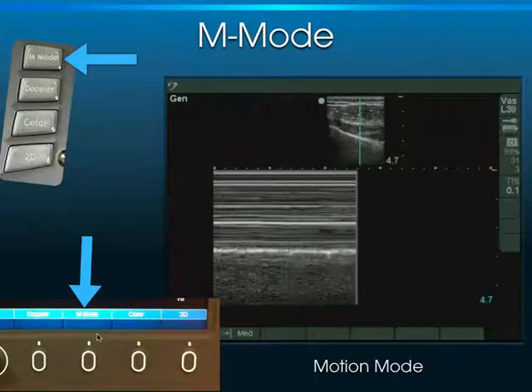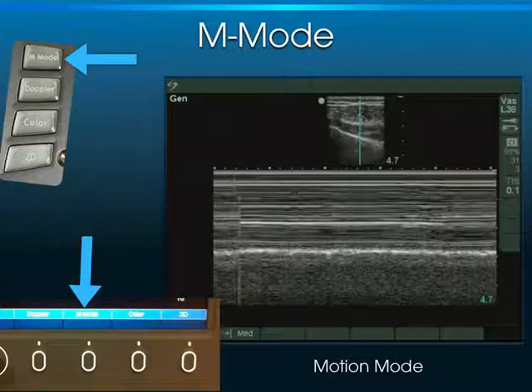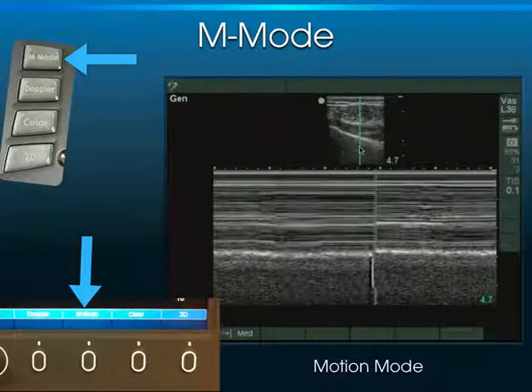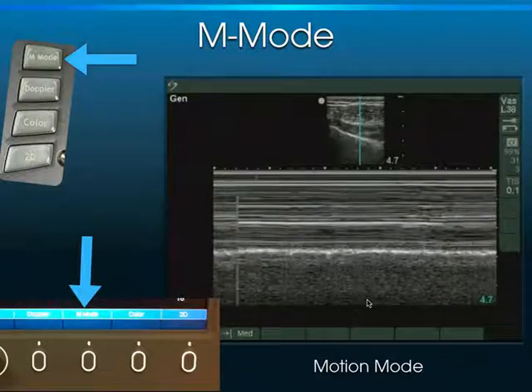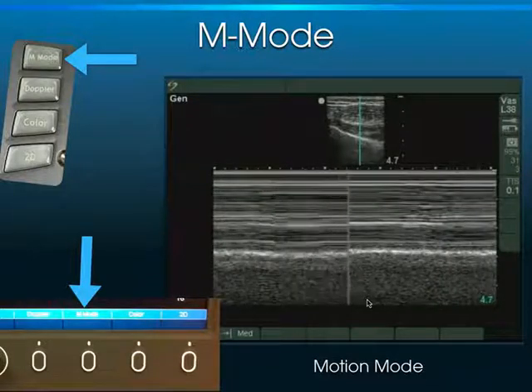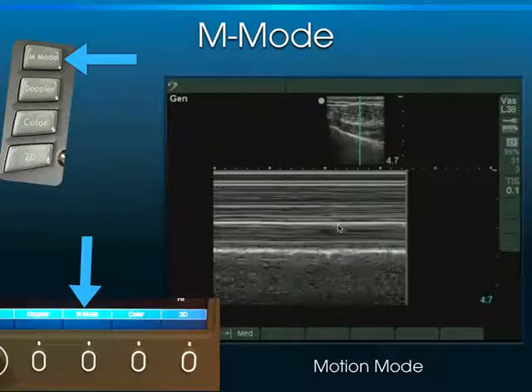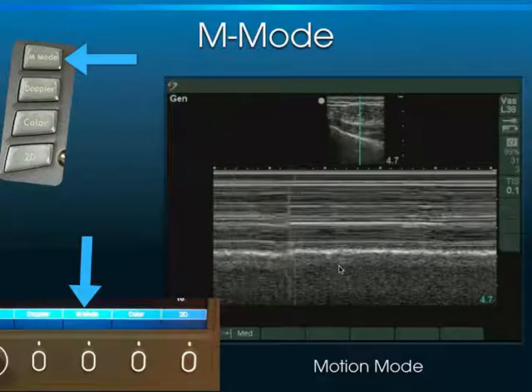Then there's M mode, which stands for motion mode. This spike going through the tissue checks for motion at different levels. The horizontal lines up here mean there's no motion. The granular appearance down here means there's actual motion — this is the pleural line at that location, which is why we see the granular appearance indicating that things are moving.